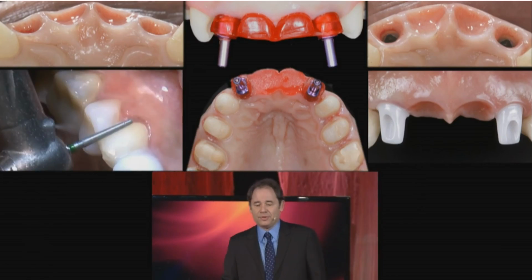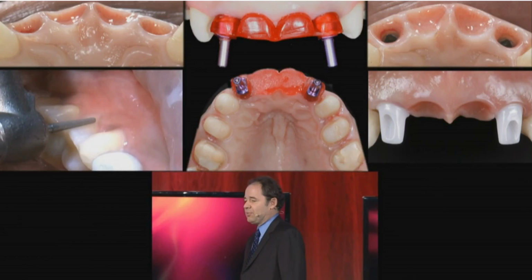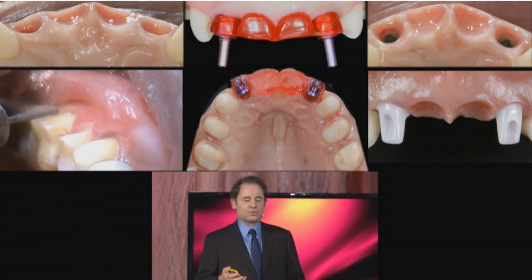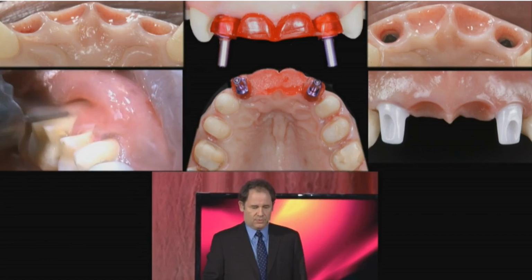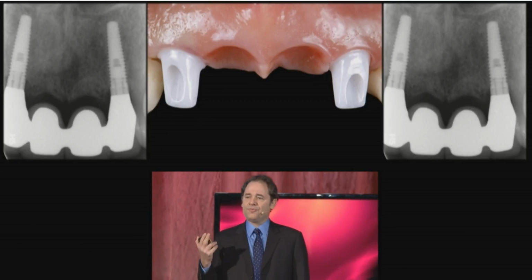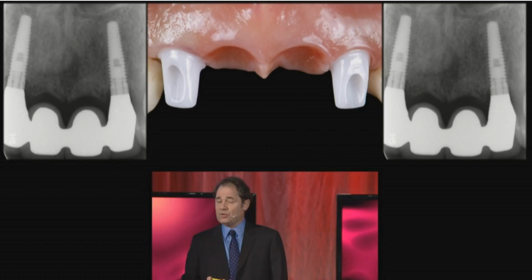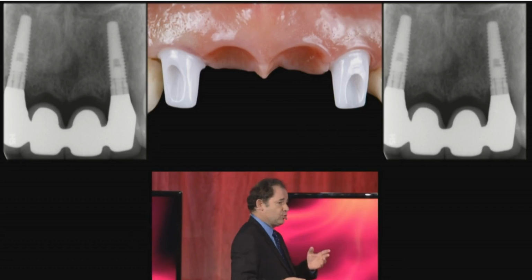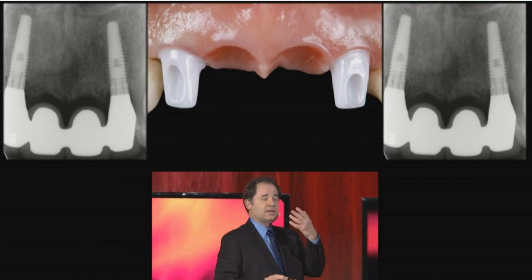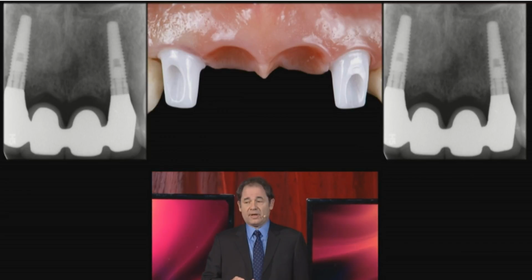So we're going back to the mouth. The pontic sites were developed in the provisionals, recorded with acrylic resin, then connected to the implant posts, and we are extending our restorations to first molars so we can have more aesthetic control for that patient. When you have a zirconia framework, you often notice that some technicians like to bring the framework all the way to the incisal edge on the lingual to give you more strength. I would caution you to be very careful with that because you do not want to block light. So make sure that you provide incisal translucency and keep it free for light transmission.